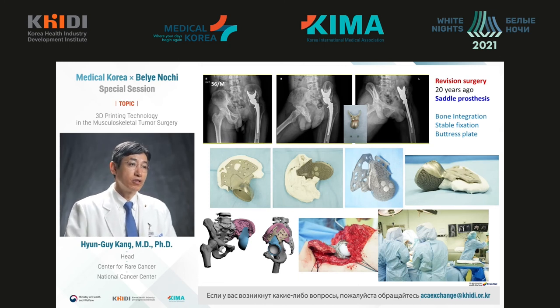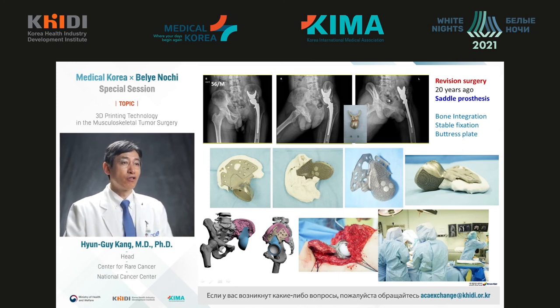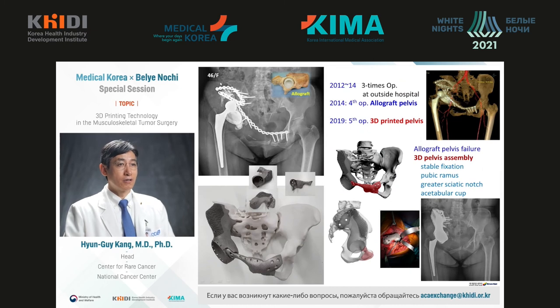Now, several words about revision surgery. A patient 56 years of age. 20 years ago, when artificial joints were not of such good quality, his hip joint was reconstructed through the ilium of his left pelvic bone with a prosthesis called a saddle prosthesis. With such a prosthesis, the hip joint is too mobile and it should be reconstructed, so we reconstructed it using a 3D printed implant.